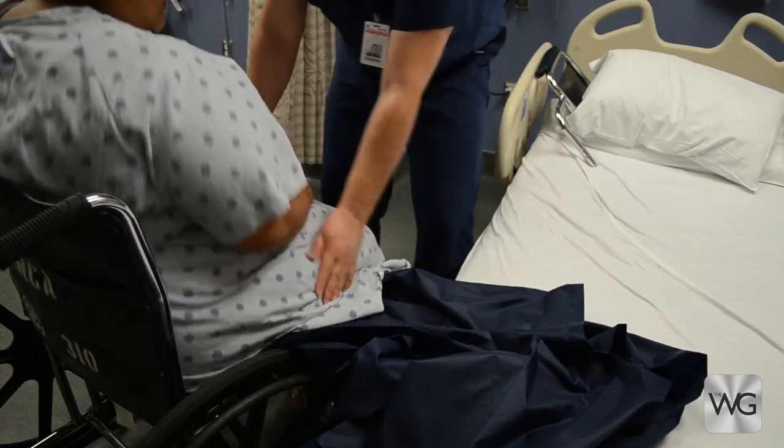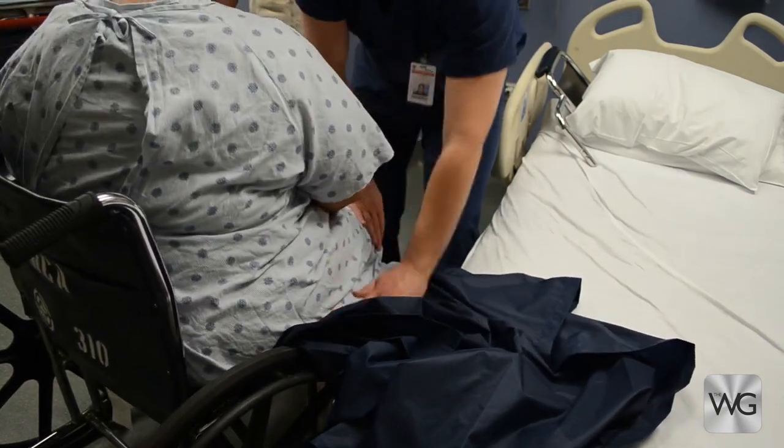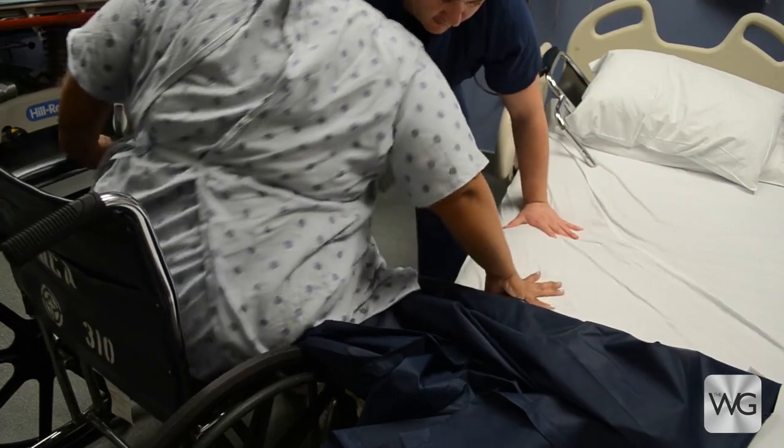Assist the patient to scoot forward in the wheelchair so her bottom slides in front of the wheel, not over it. Ensure the patient is able to place her hand on the mattress surface, not on the slide sheet.